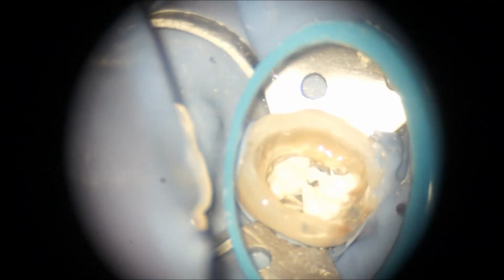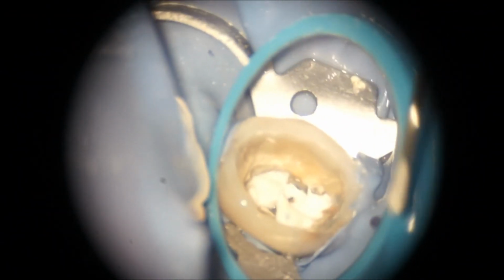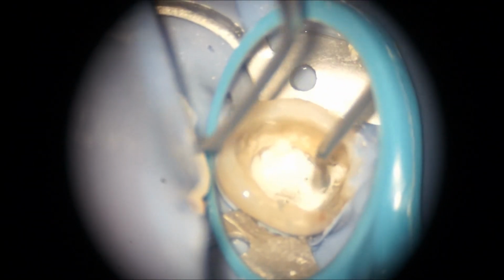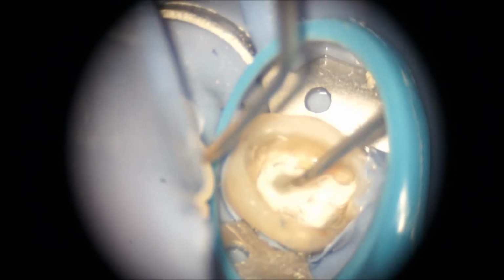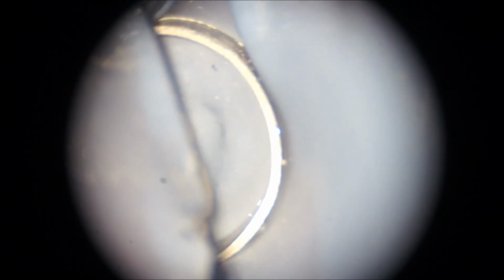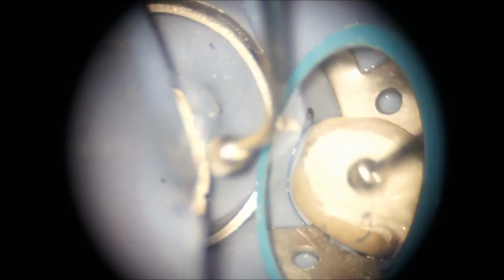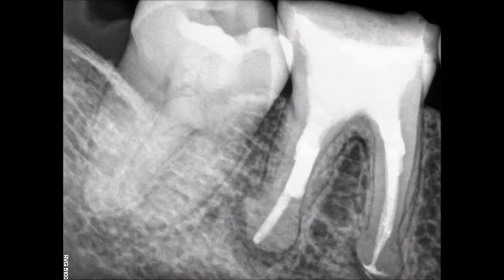The internal surface is etched just to remove the smear layer and the last of the microscopic debris that might be there. I left the GP slightly submerged below the actual orifice, and I took care to make sure that these little cavities were filled out with material before I packed the rest of the core. The material I used was Chemfil Rock from Dentsply, and you have to be quite fast if you want to add layers in between to make sure that it doesn't set on you.